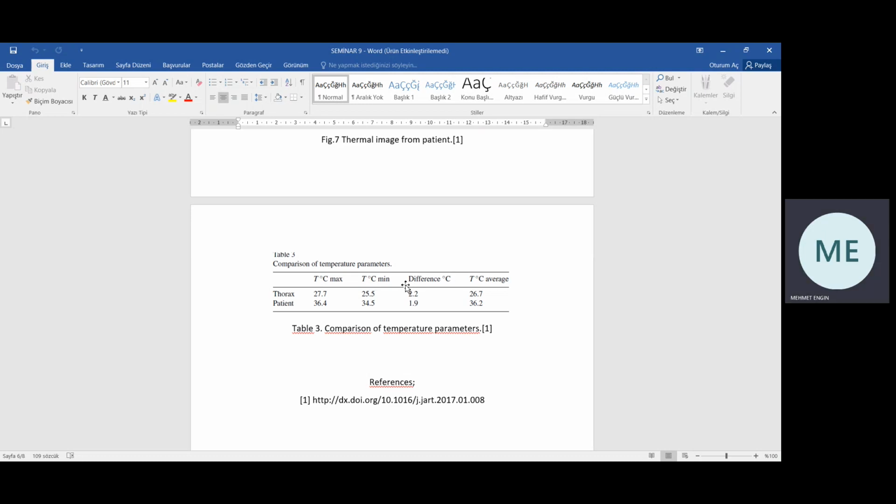Mathematical procedures could be used to adjust the operational temperatures so as to correspond to human body temperatures. From the mathematical model of thermal distribution, it is obtained that tumors with 1 centimeter of diameter located 5 centimeters deep are thermally visible.